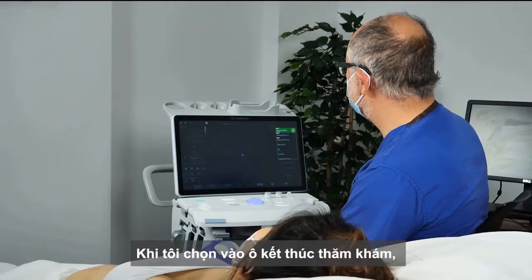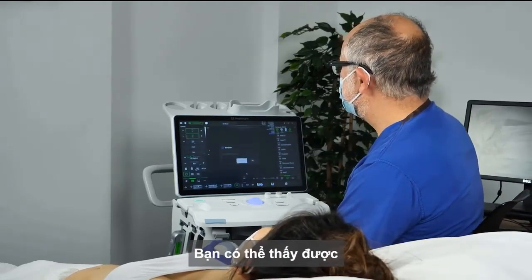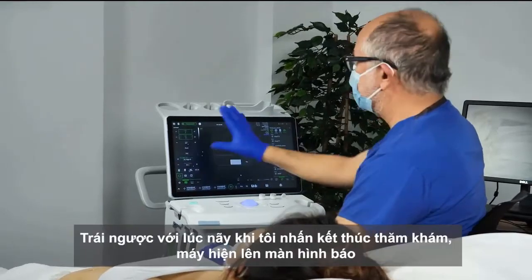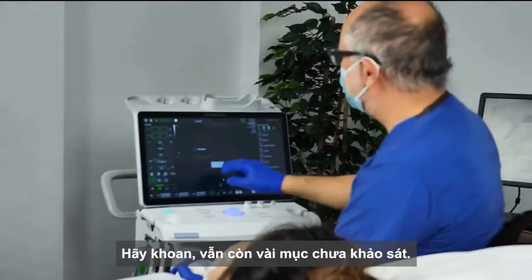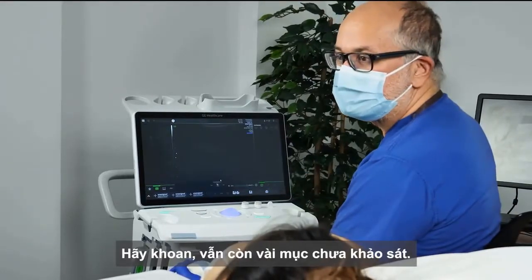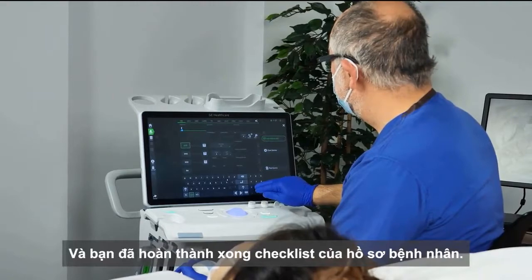So when I click here now, what you can see is that I've completed my examination, and when I click End Exam, as opposed to before, when I was clicking End Exam, it came up with that screen that said, hold on, there's some red bits here. It's now allowing me to end the examination, and then it's done.